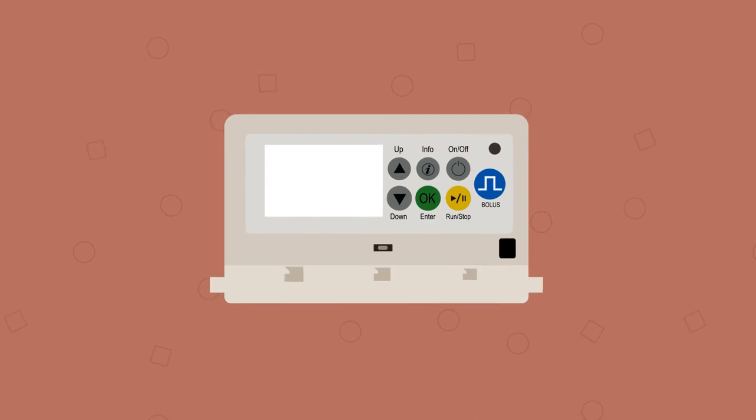Step 1: Make sure your Nimbus Pain Pump is powered off. If the screen is still on, press and hold the on/off button for 3 seconds or until the screen is blank.